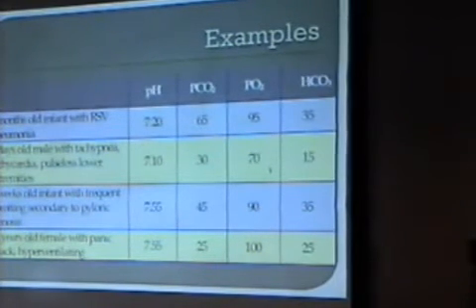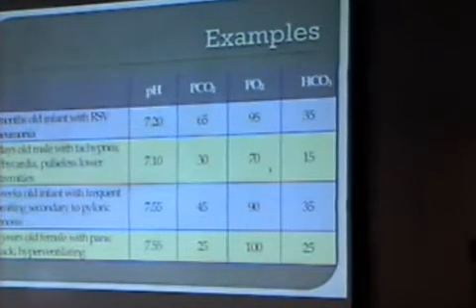Okay. 4 days old male with tachypnea, tachycardia, pulseless lower extremities. What does he have? Okay, in the blood gas, let's do acidemia, acidosis. Okay, metabolic or respiratory? Okay, we want someone from the back. Respiratory? Respiratory what? So what is the respiratory part? PCO2 30. It's what?